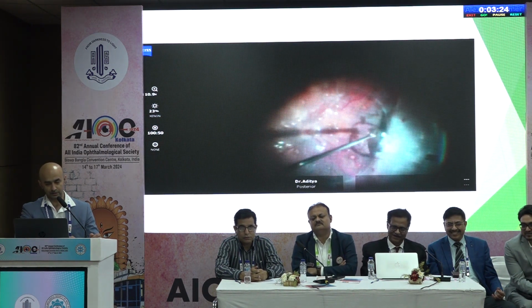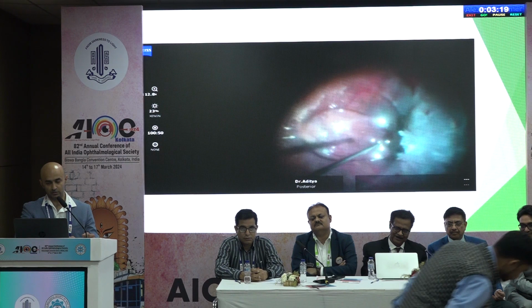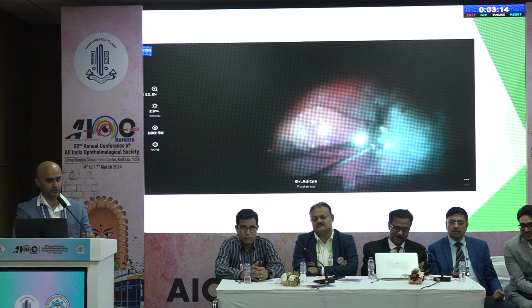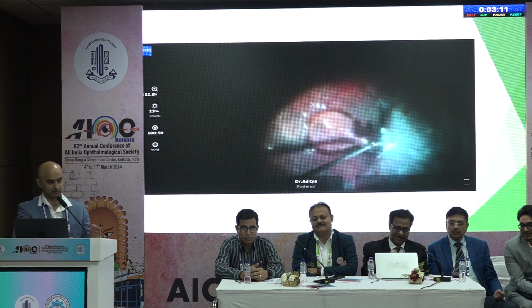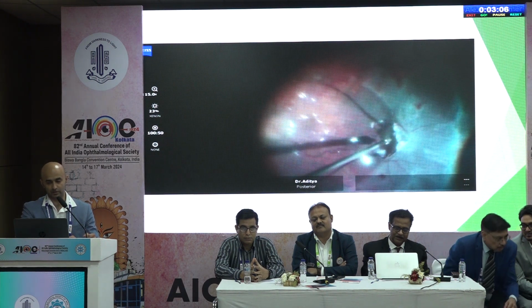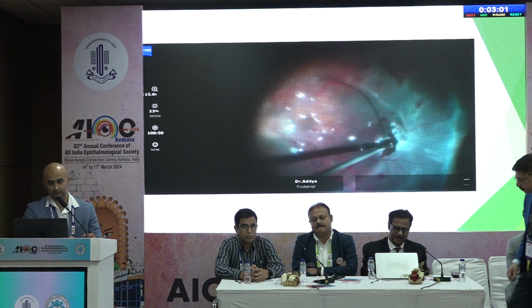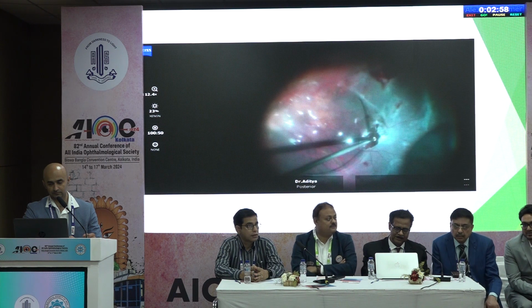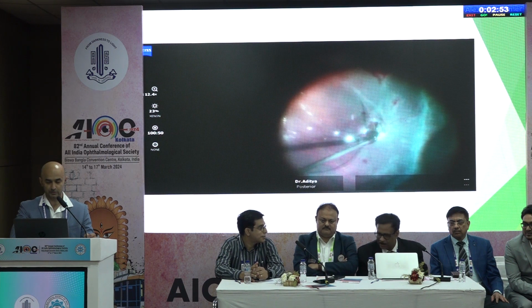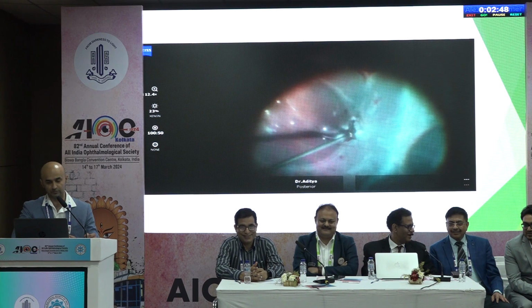But that was the only option, but at least it can create a kind of drag to pull this silicone oil out. So it's like a cyst. Maybe sometimes you can correlate it with a cysticercosis cyst, the way it comes out. So I initiate the vacuum and at least bring the silicone oil out of that retinectomy area first. And it actually makes your day extremely long because, as you know, this silicone oil is so stubborn, it doesn't come out so easily from that space.